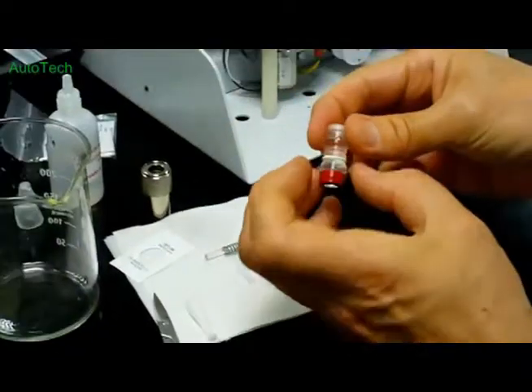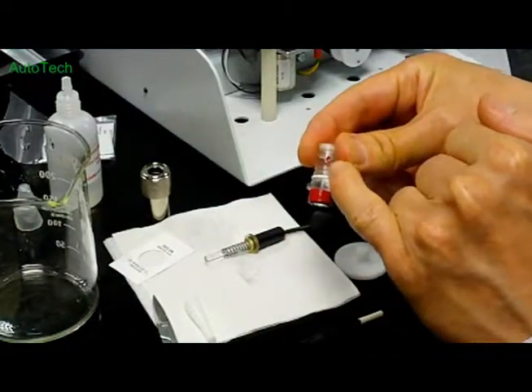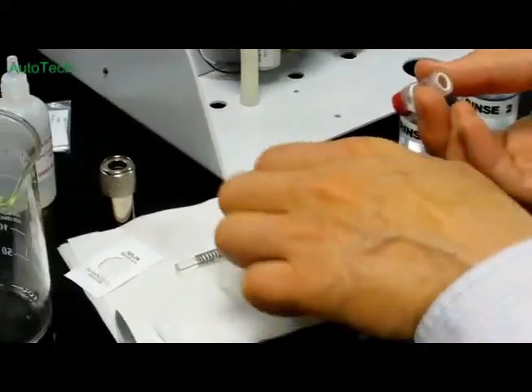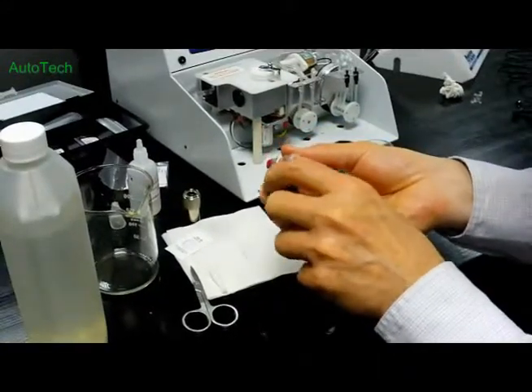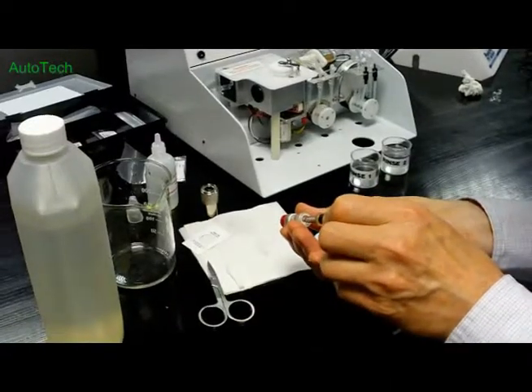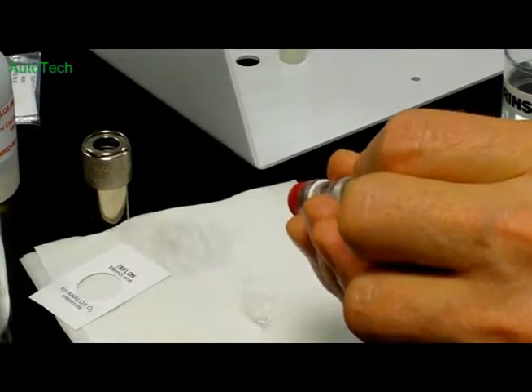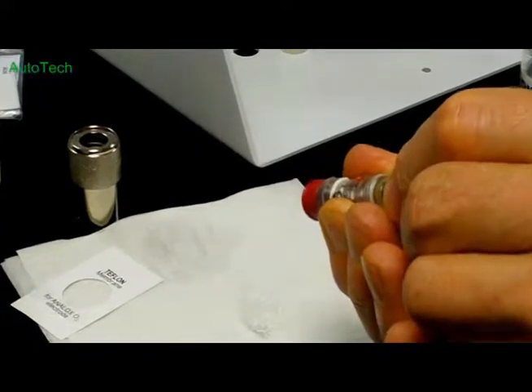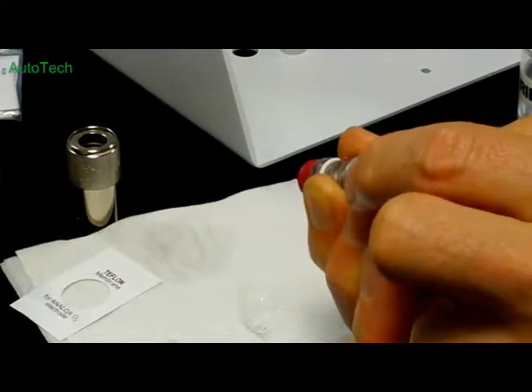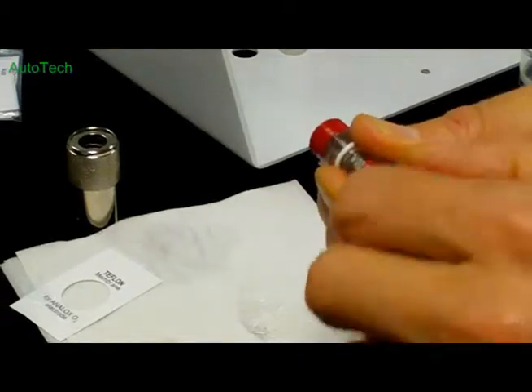Now, if you remember, we have already uncovered the bleed hole. There's a very tiny bleed hole just here, opposite the red dot, and it's important that this is uncovered at this stage. So now we're going to insert the electrode into the jacket with the red dot uppermost. So gently insert the jacket. It'll displace the electrolyte, that's perfectly okay. And right at the end, you will see a little bit of electrolyte come out. Maintaining a bit of forward pressure on the cable, gently drop the black back nut until it's firmly tight.